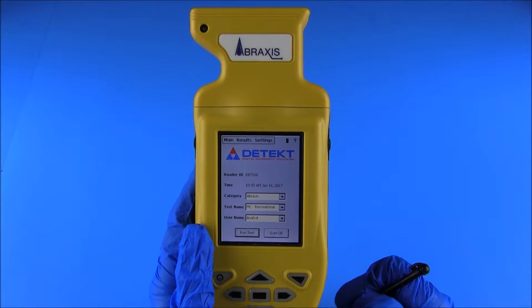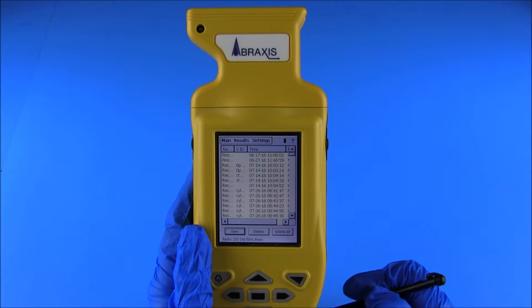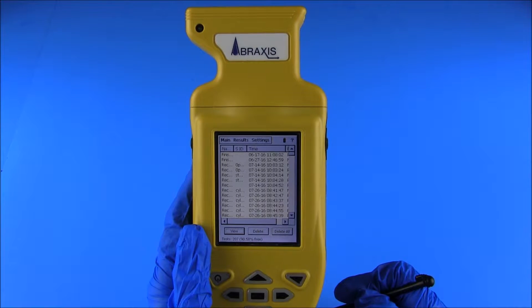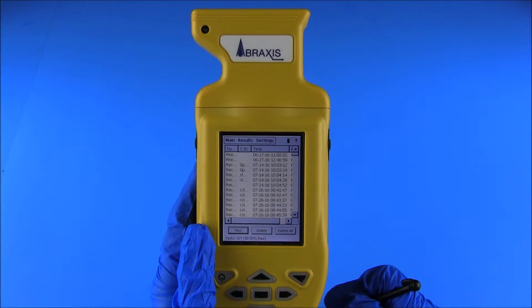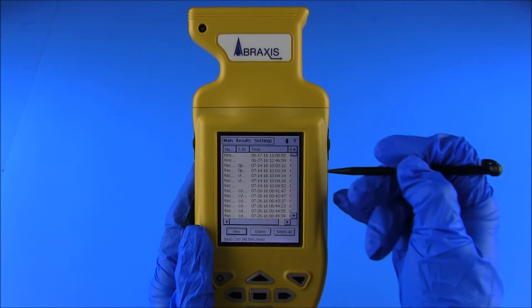Selecting the results tab from the user control menu will display the results screen showing the test name, sample ID, date and time, and results for each test. Results can be sorted by category, such as name, sample ID, time, or result, by selecting the desired sorting category with the stylus. Individual test images are viewed by selecting the desired test from the list of test results, then selecting View.